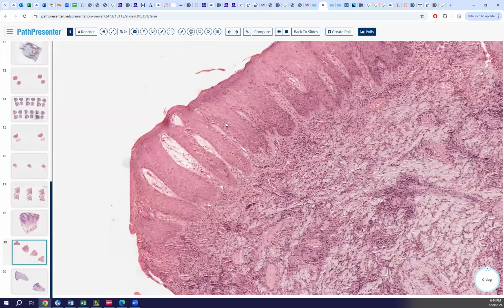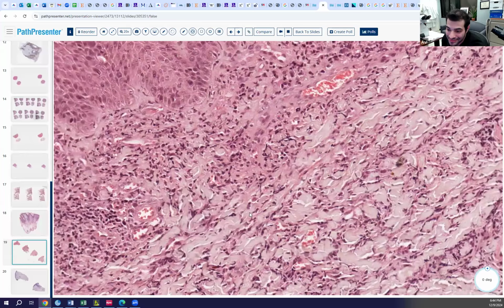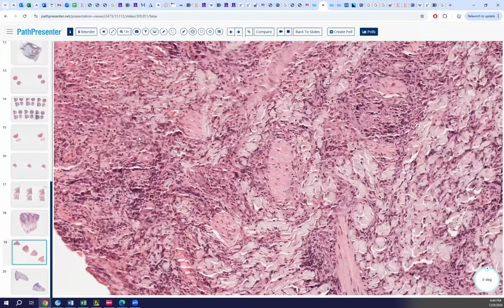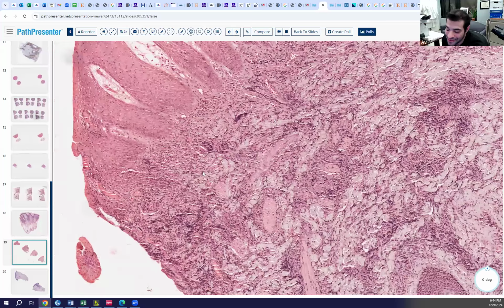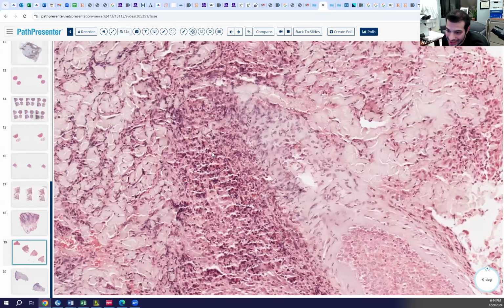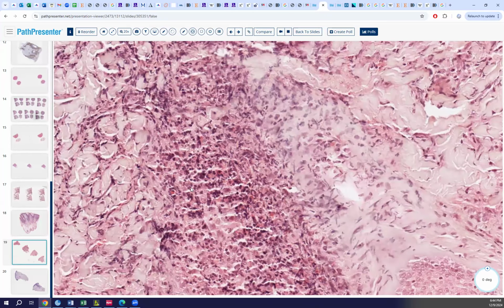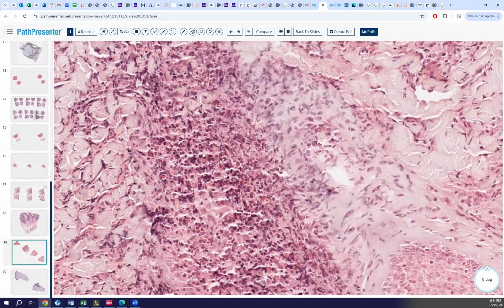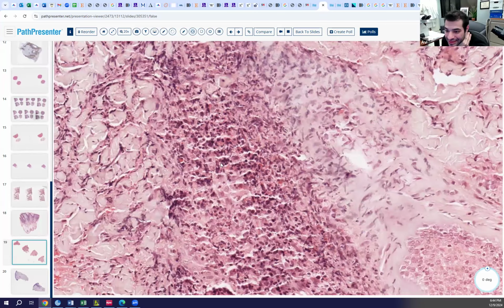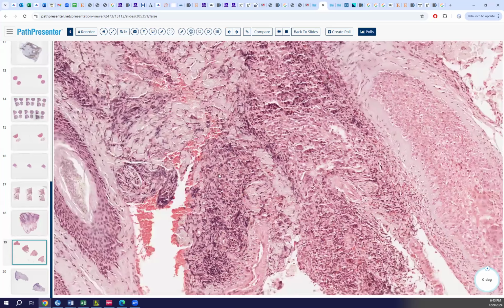A lot going on here, huh? Well, there's a lot of infiltrate here. It's almost more infiltrate than hair at this point. Okay, so what kind of infiltrate are we seeing? It's definitely mixed. Histiocytic, maybe a few neutrophils. There are definitely neutrophils here. Yeah, some lymphs as well.